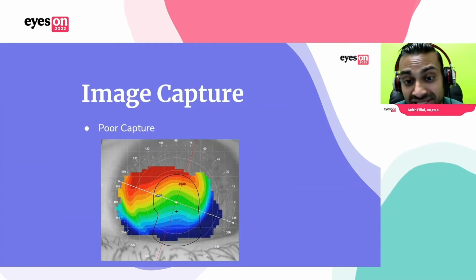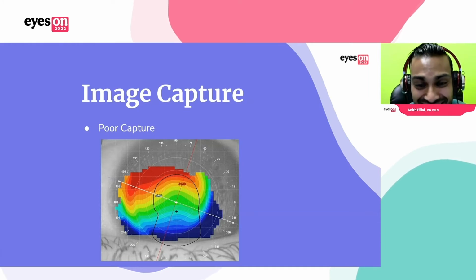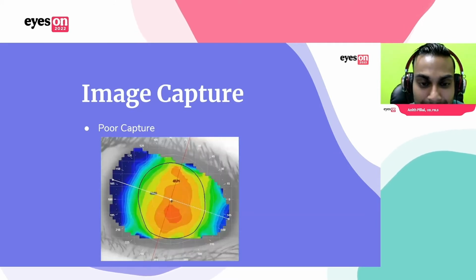And I know that it's tough to get, because these are my images. These are patients that we had. So this is a scan that we got in clinic, and I said, nope, this is not good enough. We've got to keep going and get a better image, because we can't design off of this.